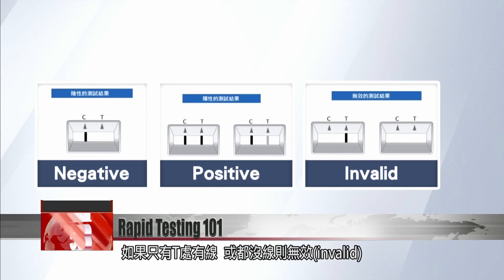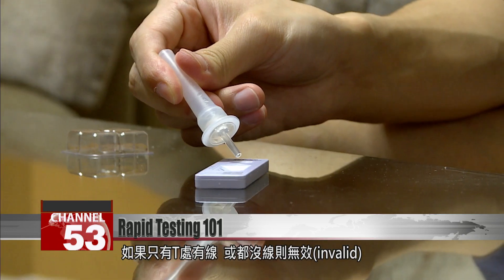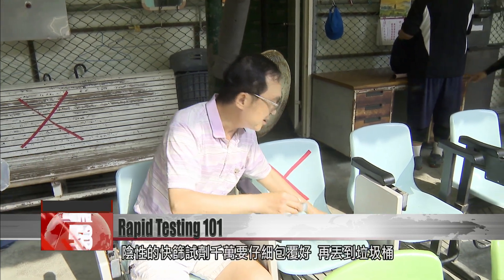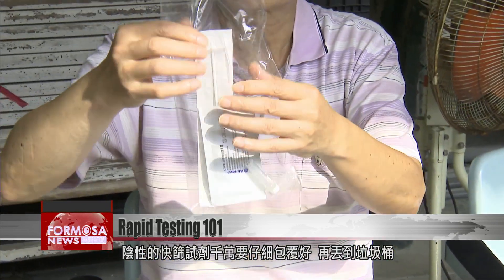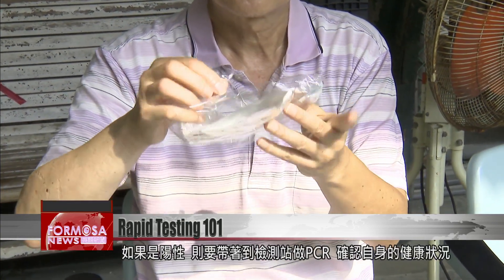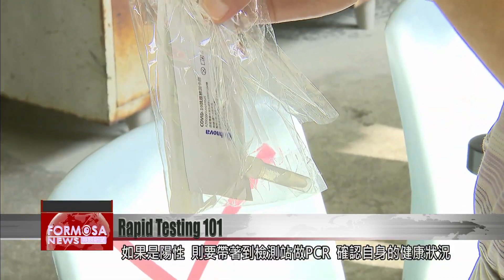If there is no line on the C but a line on the T, or if no lines appear at all, that means you have an invalid result. If the result is negative, the test strip can be discarded. To dispose of it safely, make sure it is completely wrapped and sealed first. If the result is positive, seal it and take it with you to a PCR testing station to confirm the results.